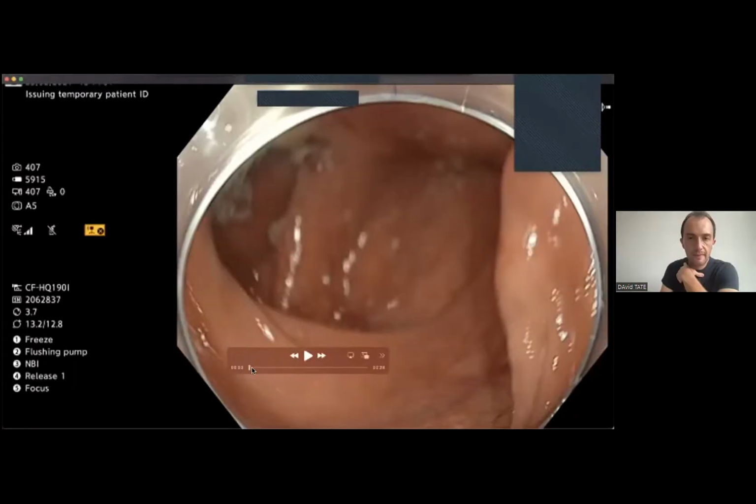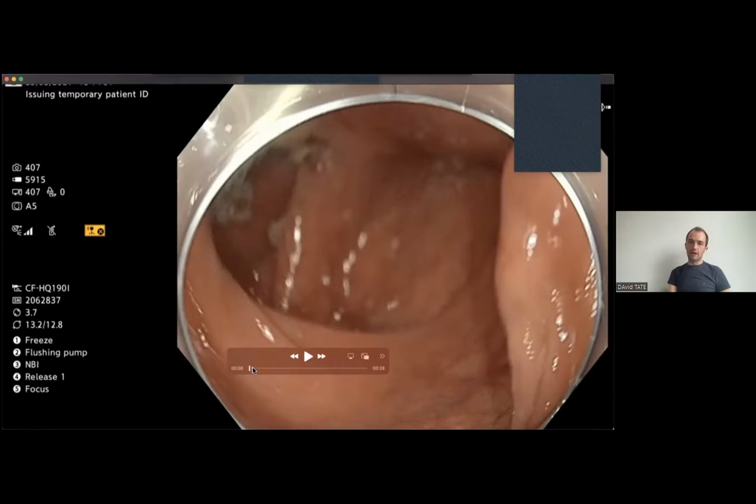So I'm going to take it through slowly, and I'm going to talk to Vikash about the structure. Remember, we didn't talk about blink impression, but there is a whole load of evidence that people's first impression matters. There's also a whole load of evidence that your first impression can be trained by seeing lots of examples of something. So the first impression of a polyp, you should train it. I think Vikash's first impression is now starting to become quite reliable. As you've seen more polyps, you can really use your first impression and you shouldn't go against it. Often the times I find myself going against my first impression, I'm wrong. So adding detail to the first impression often doesn't work.